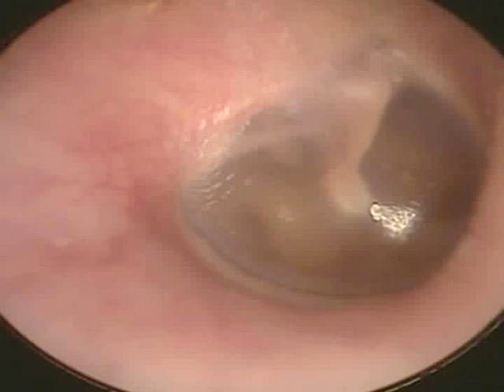The malleus bone has got sections. It is the handle of malleus and the short process of malleus, that you must be able to see through the otoscope. They must be visible. The handle of malleus and the short process of malleus, which comes out on the tympanic membrane like a tip. Okay. The other thing you must also observe on the tympanic membrane is the light reflex.